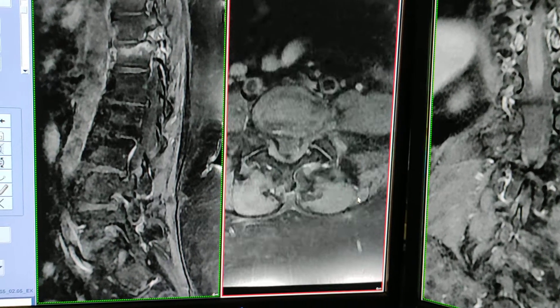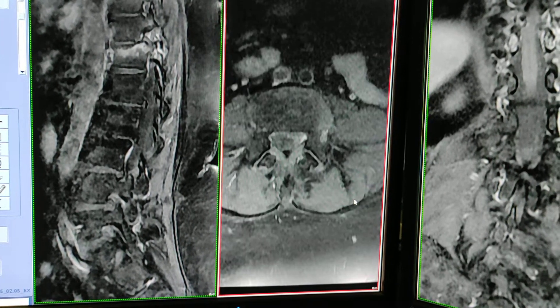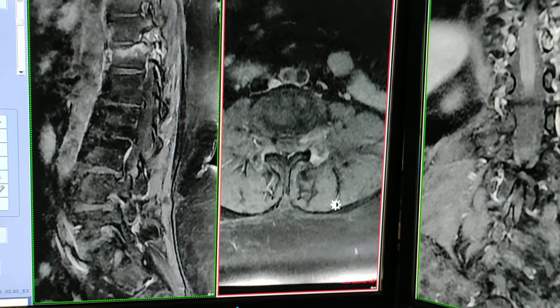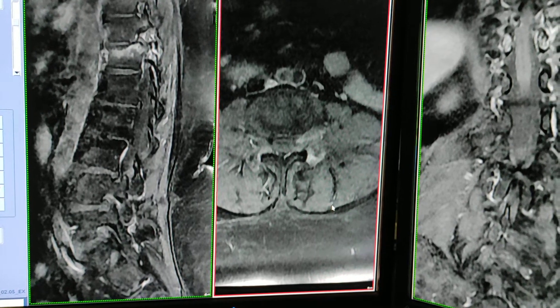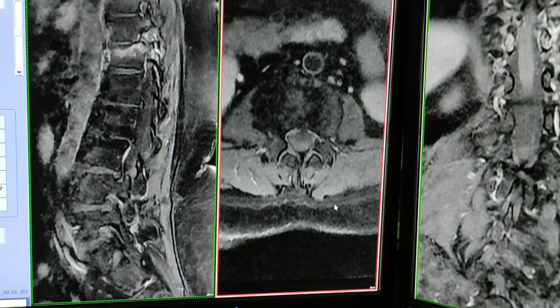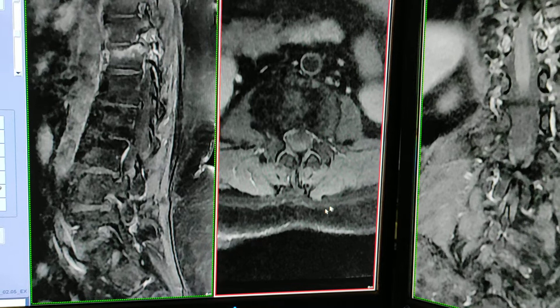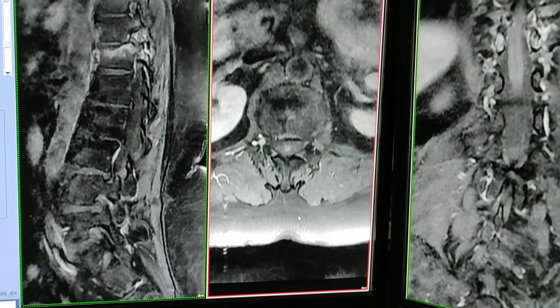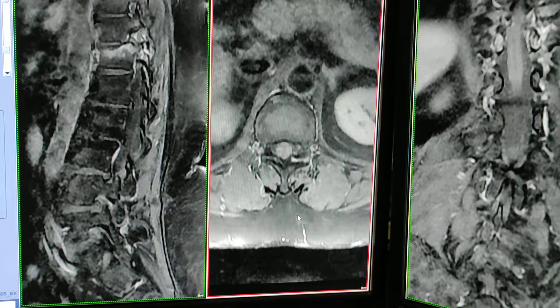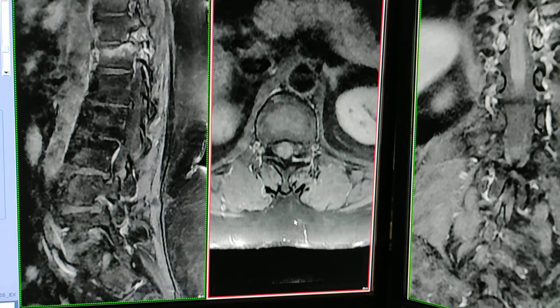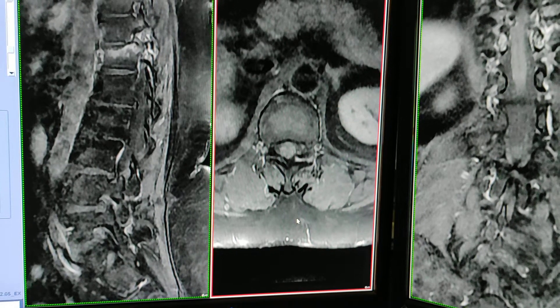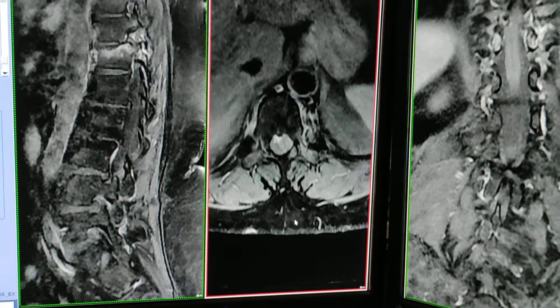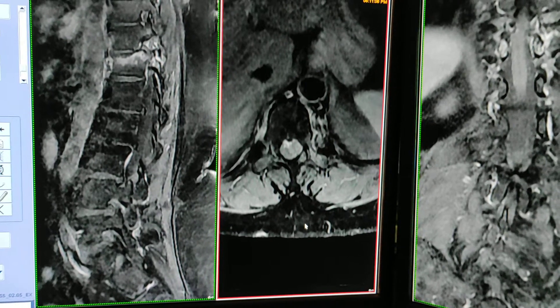5ml of gadolinium contrast was given, followed by a normal saline flush of 10ml pushed. That is sufficient contrast administration for this case.